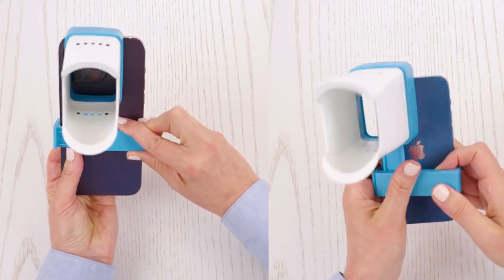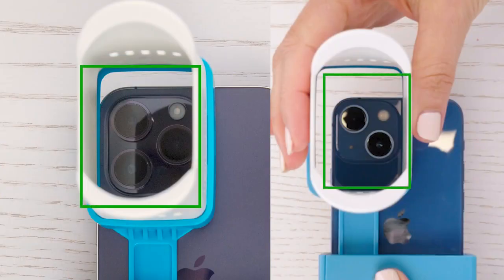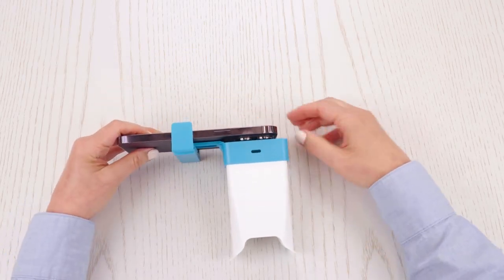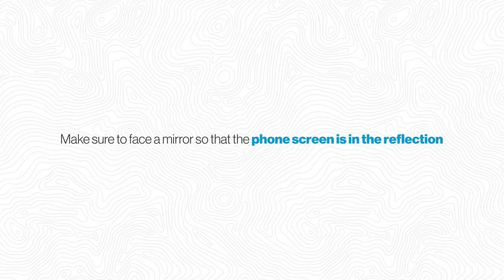Step 3. Connect the slider to one side of the phone and pull the adjustable slider grip to fit around the phone, making sure the camera is centered in the lens. The lens setup is now complete. Now it's time to take photos and submit them to your doctor. Make sure to face a mirror so that the phone screen is in the reflection.